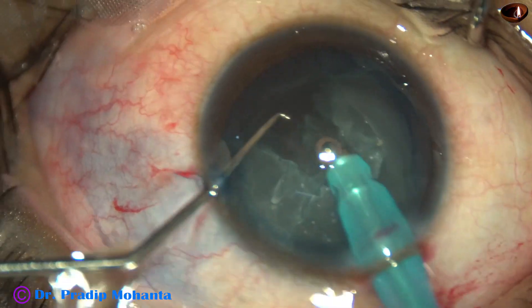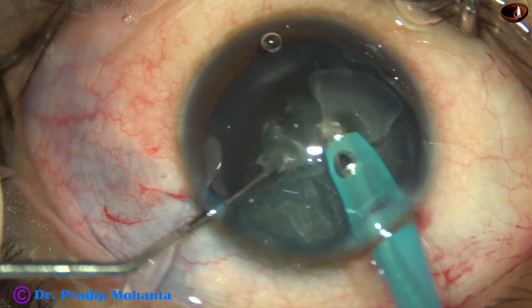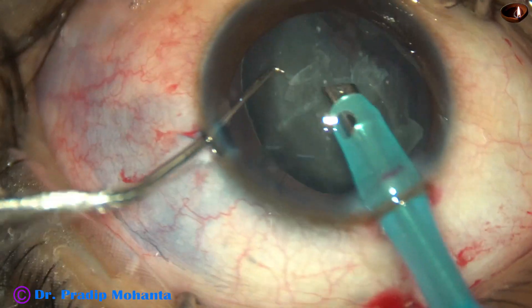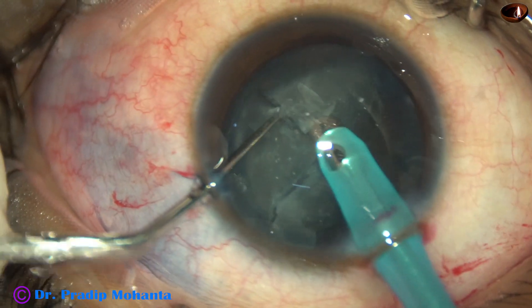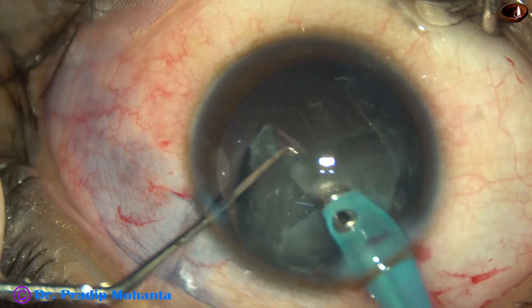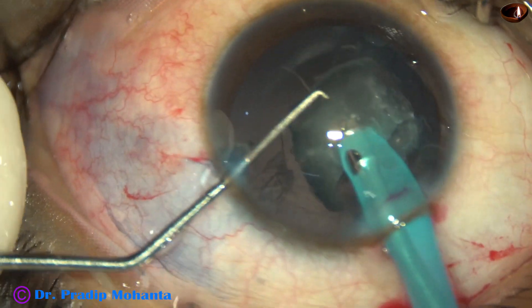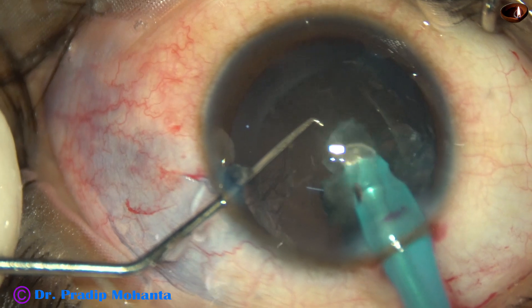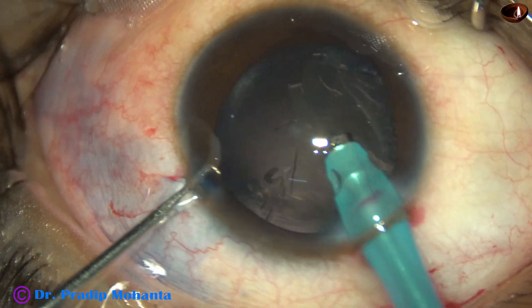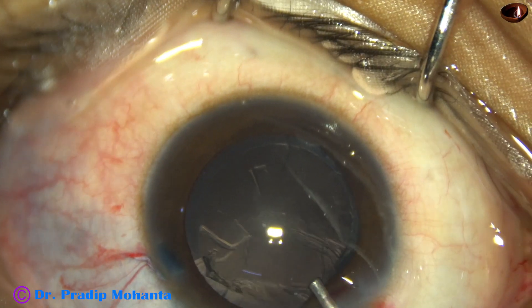The nucleus is brought out of the capsular bag. The pre-chopper on the heminucleus has already come out, and then the other heminucleus is also removed. The pre-chopping helped to some extent in getting the pieces.